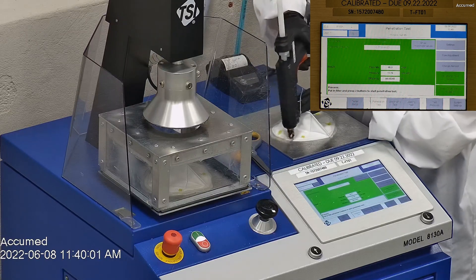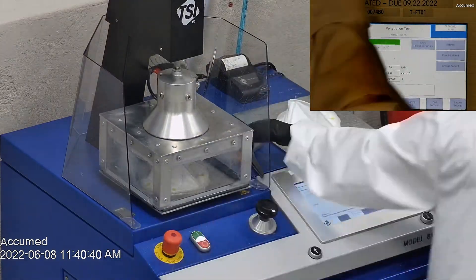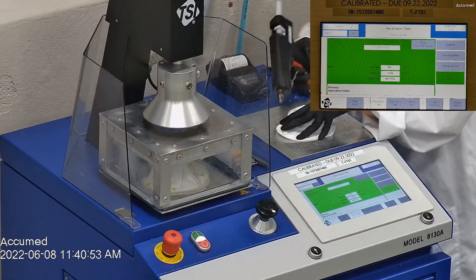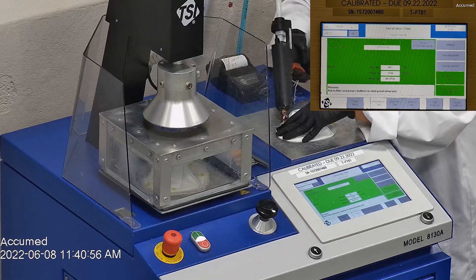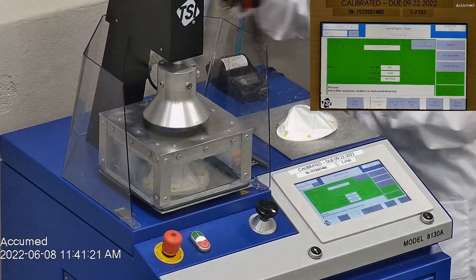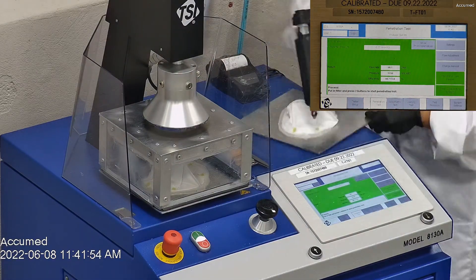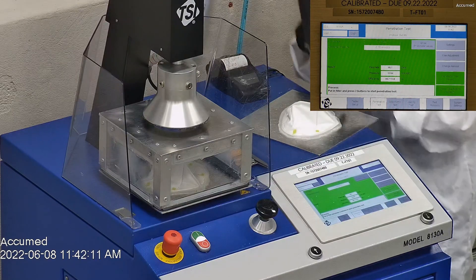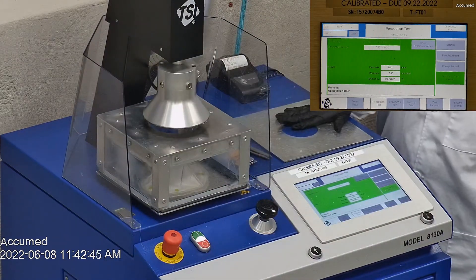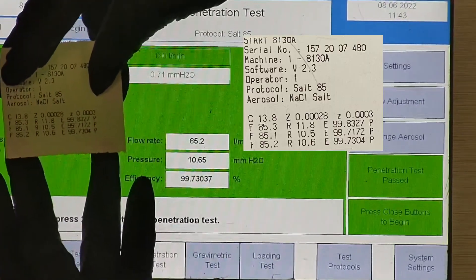The first sample tested at 99.83% filtration efficiency and had a pressure drop of 11.8 millimeters of water. The second sample had a filtration percentage of 99.72% and a pressure drop of 10.5 millimeters of water. The third sample's filtration percentage was 99.73% with a pressure drop of 10.6 millimeters of water.